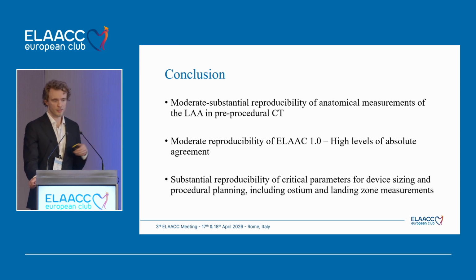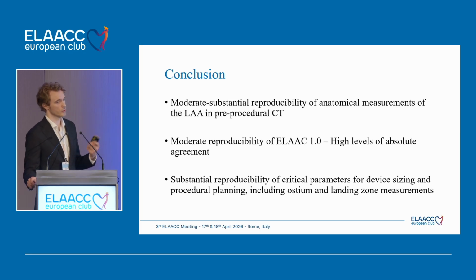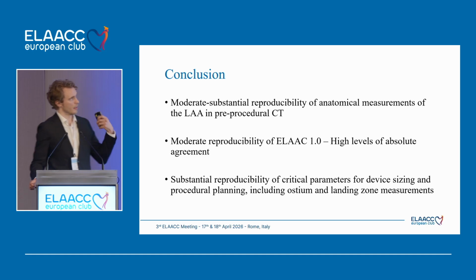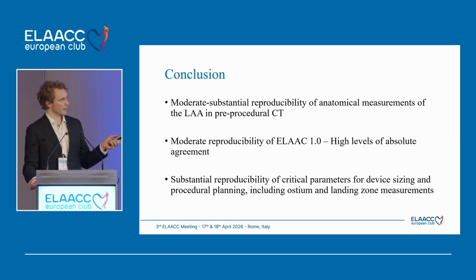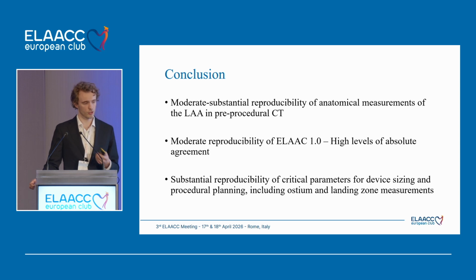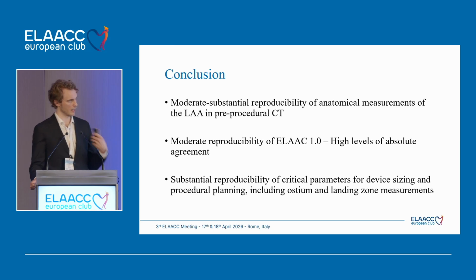So, to summarize the present study, we find moderate to substantial reproducibility for most individual anatomical measurements of the LAA. We find a combined ELAACC score with a moderate reproducibility by the kappa statistic, but high levels of absolute agreement in the linear weighted analysis. And we find that certain critical parameters, which are so important in device sizing and strategic planning in the pre-procedural stage, show substantial reproducibility, including all measurements at the ostium and the landing zone.